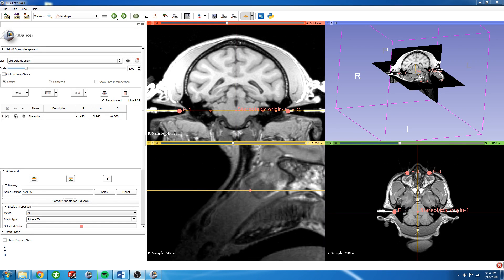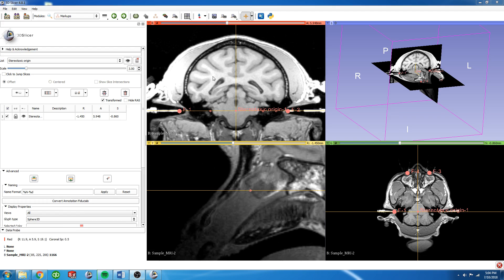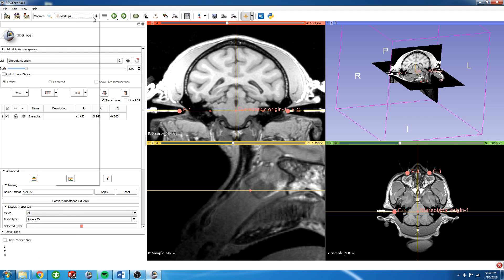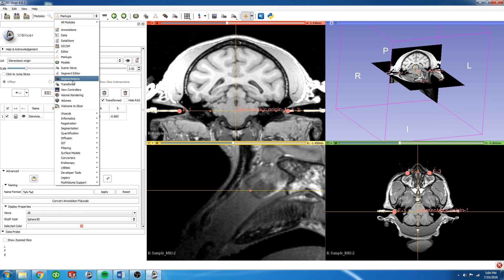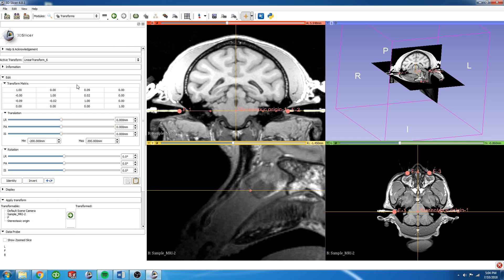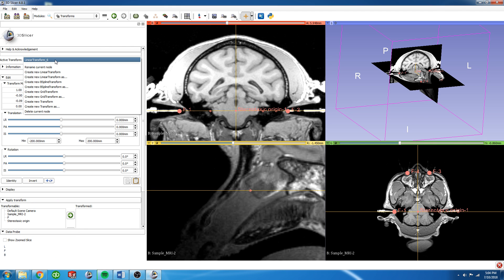To translate this entire MRI so that the stereotaxic origin aligns with the 3D Slicer origin, we need to go back to the Transforms drop-down menu and create a new transform.